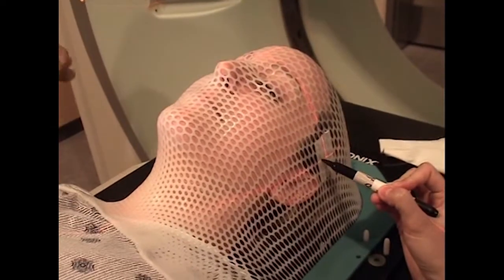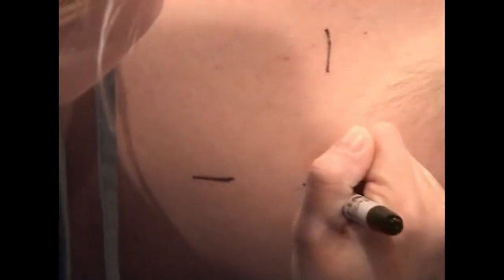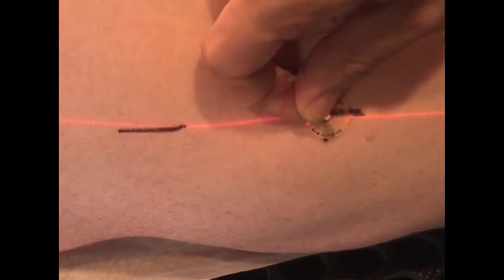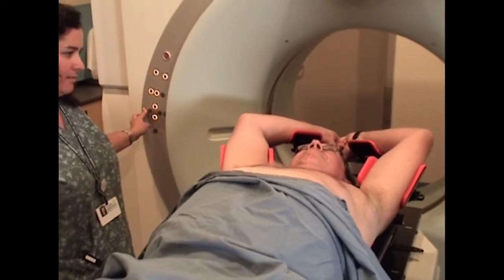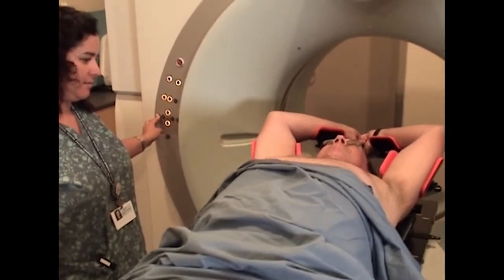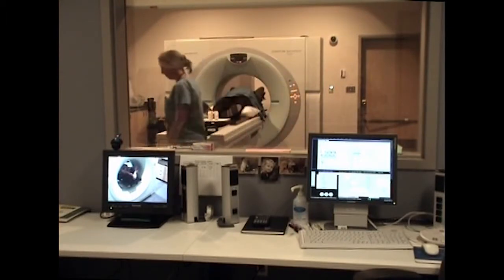It is very important that you are in the same position for your simulation as you will be during radiation treatment. Once satisfied that you are positioned correctly, the therapist will place marks on your skin. Small beads will then be placed on these marks. These are visible on the completed CT scan. The couch you are resting upon will then move you into the scanner.